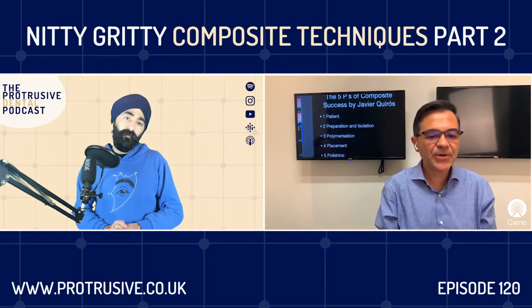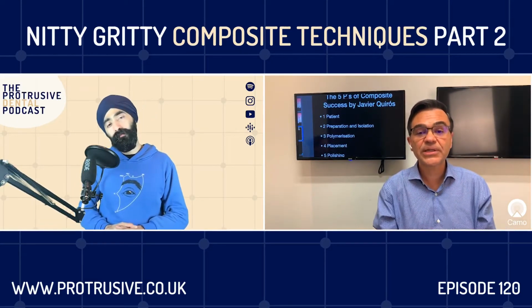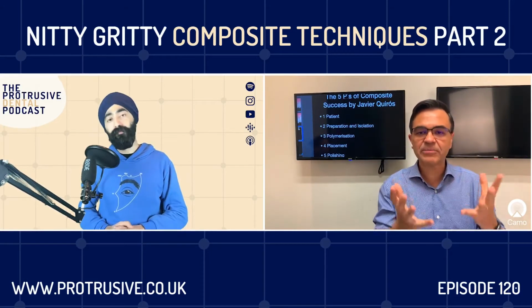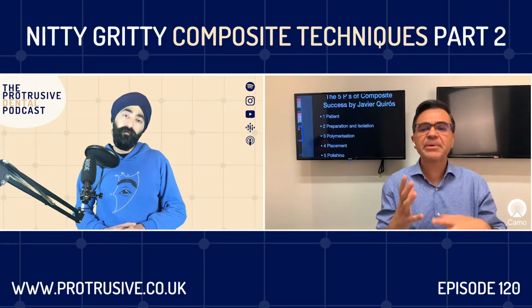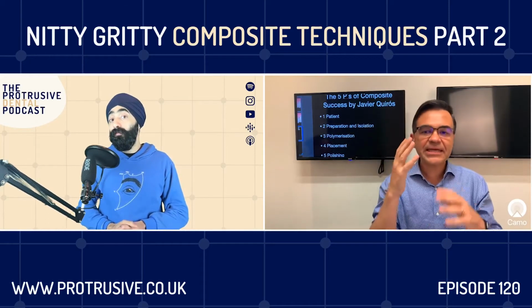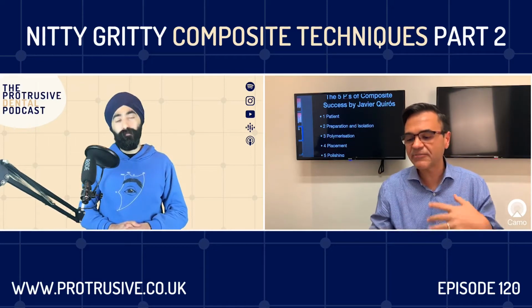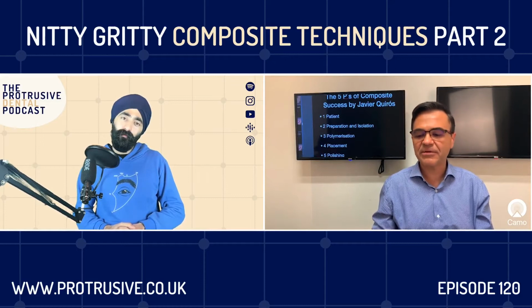Yeah, curing lights, it's a big deal. I also try to get rid totally of the oxygen inhibitor layer at the end. So I put some glycerin around my veneers at the very end. Once I cure them, I put some glycerin and then I cure them again, and then I find out that I get less staining in between teeth, and I get better polishing because I got rid from the beginning of the oxygen inhibitor layer, Jazz.